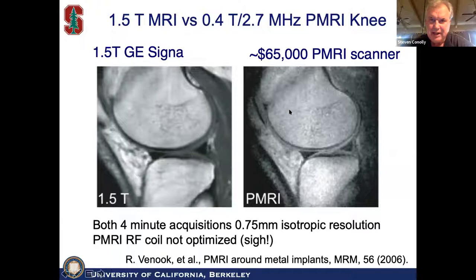Here's a 1.5 T scanner on a normal volunteer. You can make out all of the good cartilage, though the signal-to-noise ratio is down. We didn't optimize the RF coil, but it's a pretty good image for this kind of cost. There was a very nice reduction of the susceptibility difference — the chemical shift difference between the fat, bone, and cartilage.